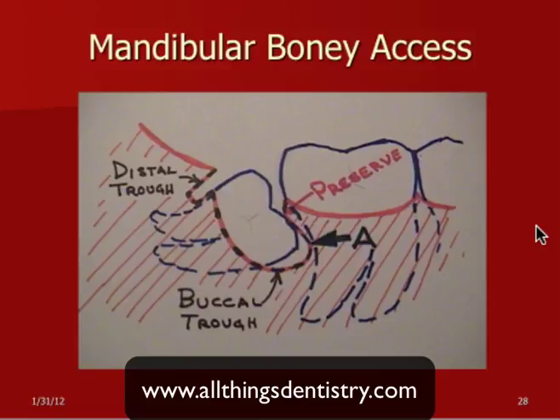So by Striker you mean the straight? Striker and Osteomed are brands of surgical hand pieces. They're big straight hand pieces. Both of them are electrical motors.